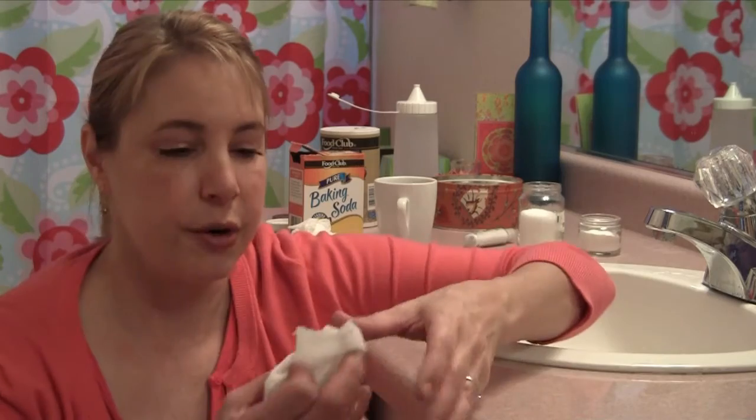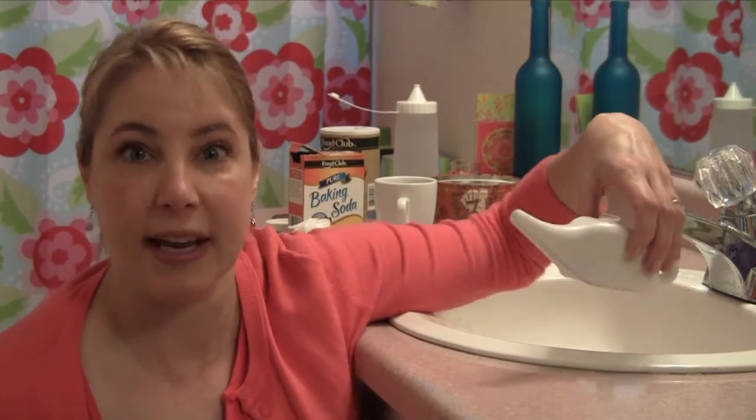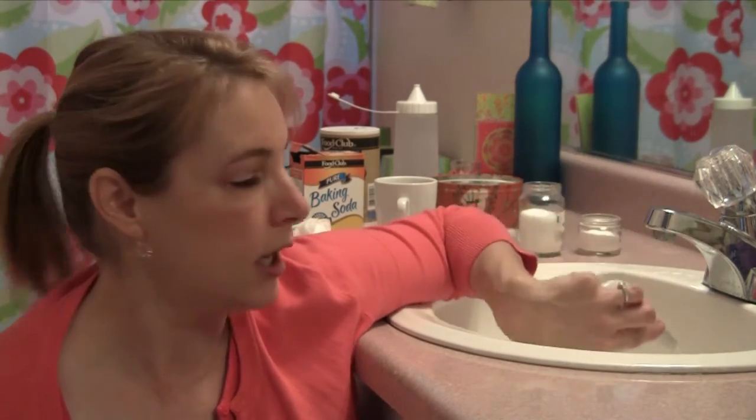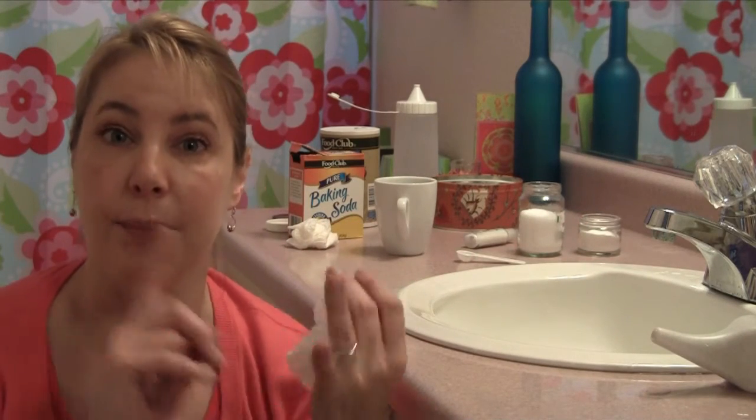Super easy. So remember, again, very simple tools. Get yourself a little neti pot. It can be cool, simple like this, or it can be fancy, made out of agate. I don't care what kind you get. In neti pot for travel, I'll show you mine, which is totally different. You need the non-iodized salt, you need the baking soda, a little bit of water, you're good to go.